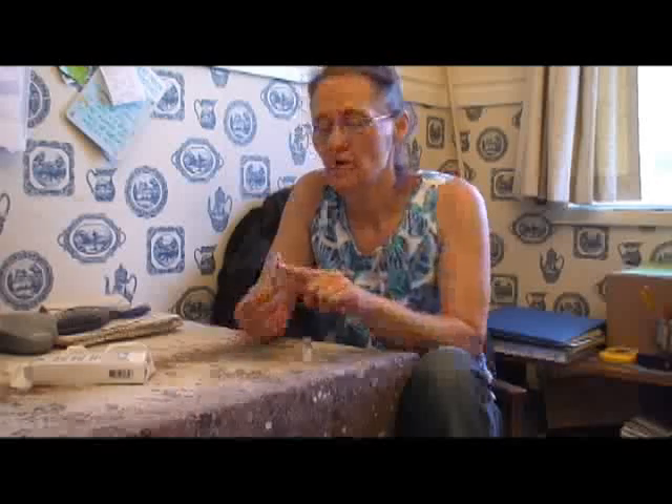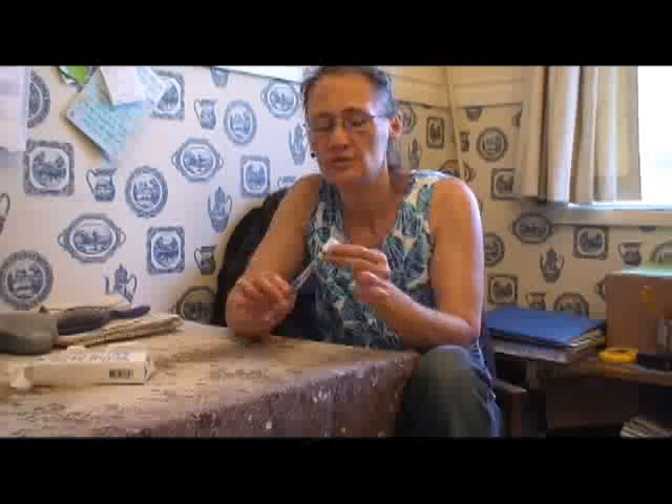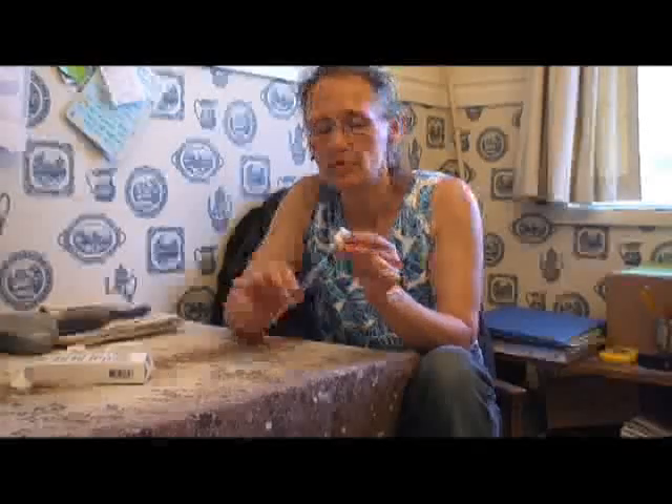Here you have your liquid. In this little vial is the sugar. You take your cap off your needle, put all of this liquid into the bottle. Take the bottle off, shake vigorously to mix it. Once it is totally dissolved and mixed, put your needle back in, put the liquid all back into the needle.